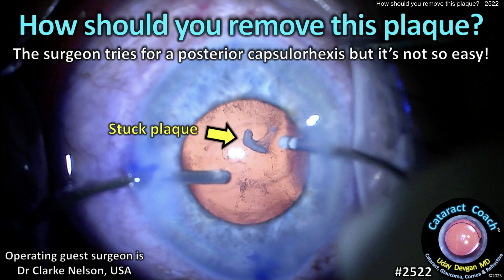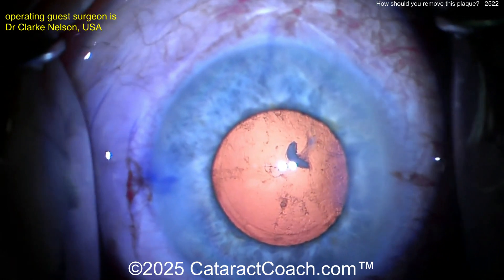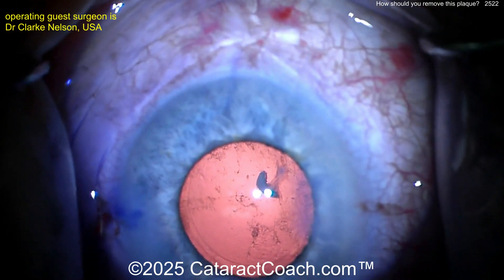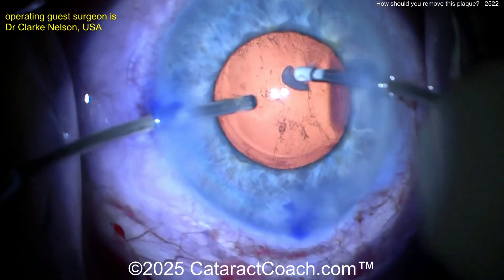cataractcoach.com. How should you remove this plaque? Now the surgeon tries for posterior capsulorrhexis, but it's not always that easy. The patient already had a prior vitrectomy. Now the patient had cataract surgery here. The patient is on the table. You can see the cataract has been removed. The capsular bag is pretty empty here.